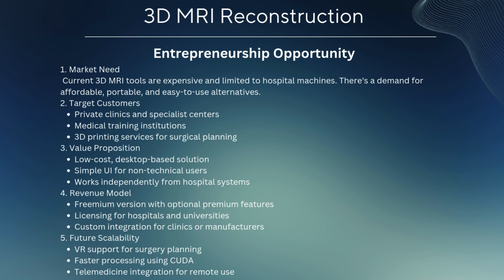Lastly, there's a strong potential for future scalability. We can enhance the system with VR support for immersive surgery planning or enable CUDA-based parallel processing to handle larger datasets faster. It can even be adapted for telemedicine use, allowing remote specialists to interact with patient scans in 3D. So overall, this project is not only technically impactful but also has strong commercial potential in the healthcare and education markets.